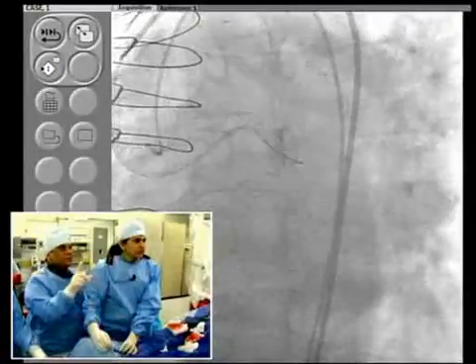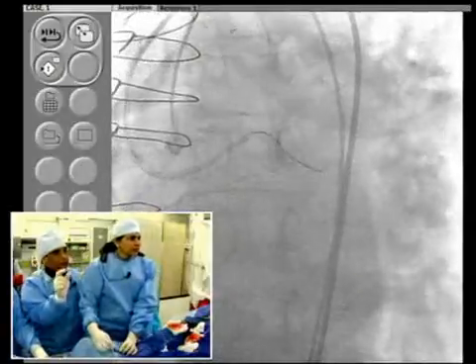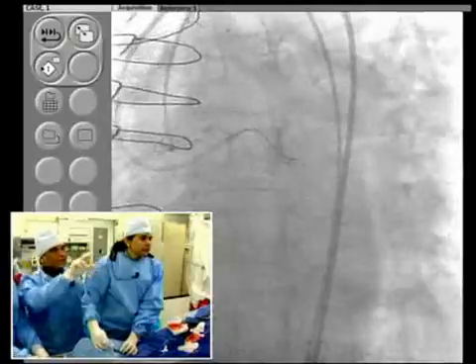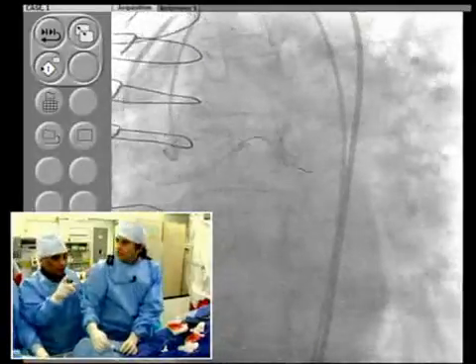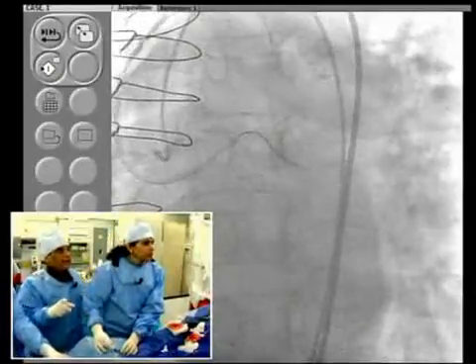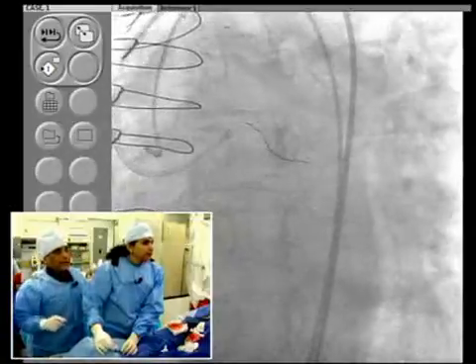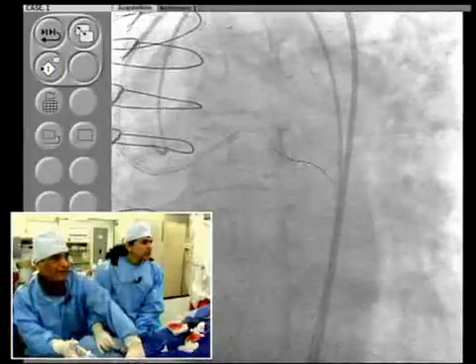Now, proximal LAD has the disease before the septal, so you need to be careful that LAD does not close. So here, if I had to put a stent, I'll take care of the left main and the circumflex and LAD plus minus. For that, going through the LIMA gives me confidence. Yeah, going through the LIMA is a big issue because it requires rotational atherectomy and it's a diffuse disease. Therefore, I won't count that much, and clearly the circumflex is a very big vessel.